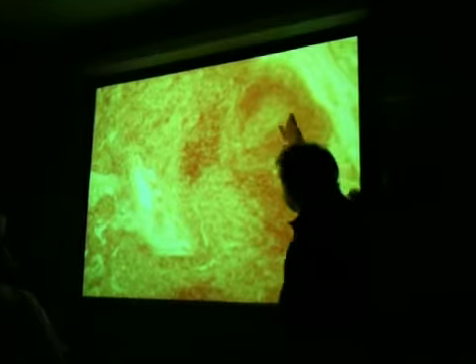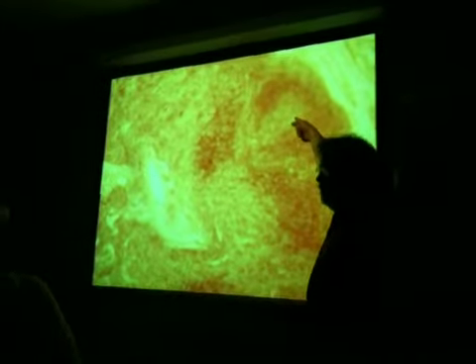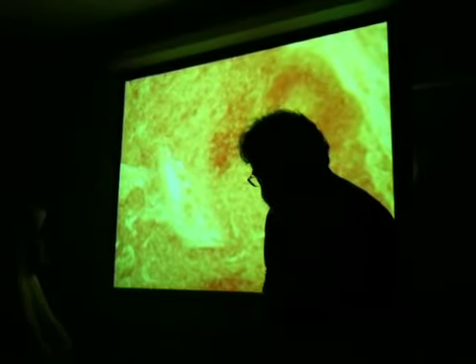What do we call this center? Germinal center. What do we call this cell? Is this a B or T cell that I'm pointing to? It's not in the picture. What do we call these sinuses in here? And what do we call all the stuff between the medullary sinuses? Medullary cords. Okay? That's it for the lymph node.